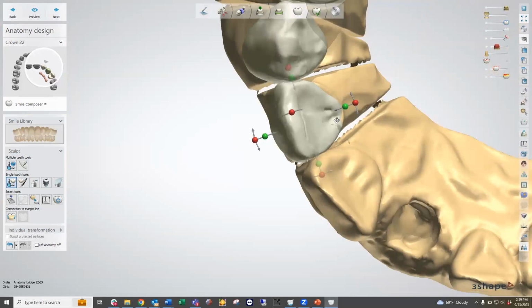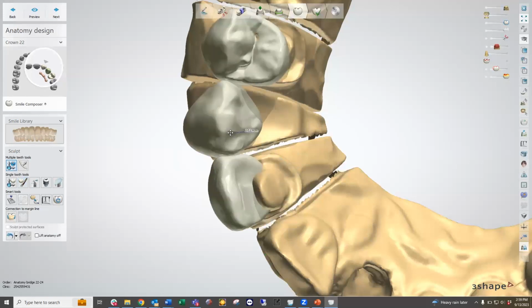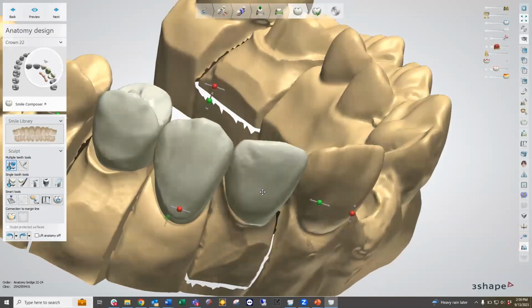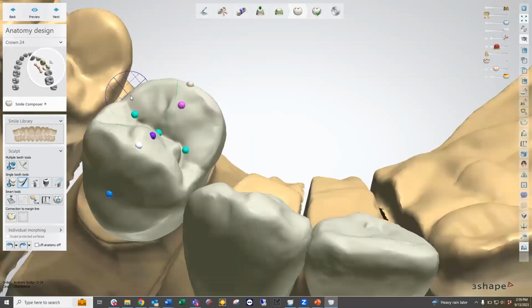So that looks fine. Again, I could spend more time on the change, but I really want to go over the details and the differences within these settings. The biggest one is that during this stage, we have an additional option, which is to move the teeth as a group function. Much the same as with our crown designs, we're going to go through the same processes that we went through previously. I'm going to say that I have them correctly situated where I want them to be, and I'm going to make my necessary adjustments over here.